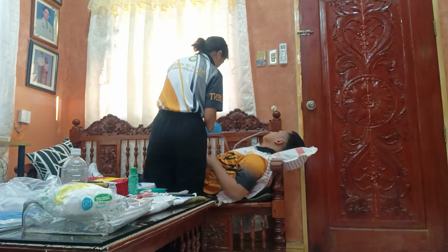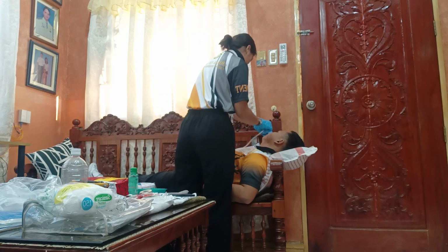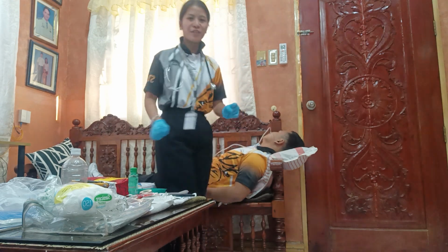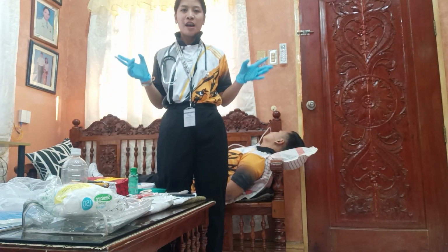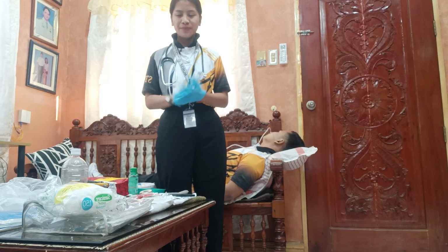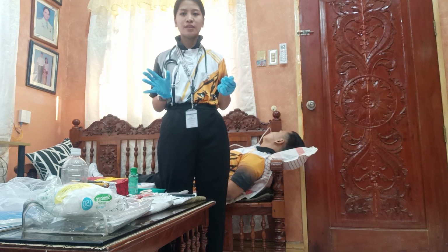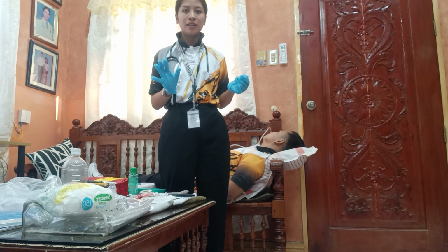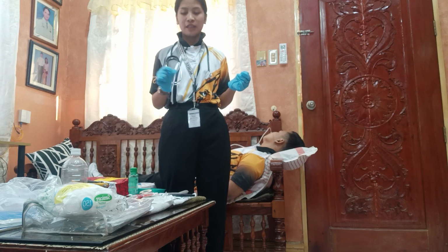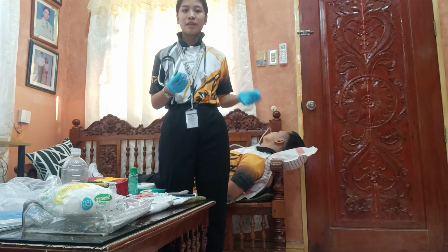Secure po natin. And after po nun is measure the length of the exposed tube and mark the tube at the nostril with a marker. Ask the patient to turn their head to the side opposite to the nostril where the tube is inserted, and also secure the tube to the patient's gown by using a rubber band or the tape and the safety pin.